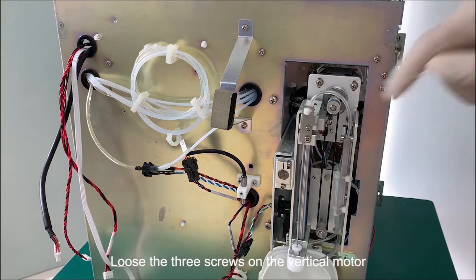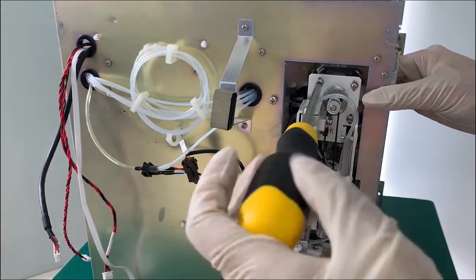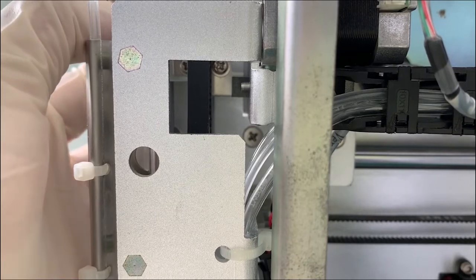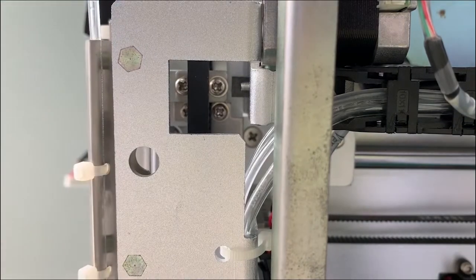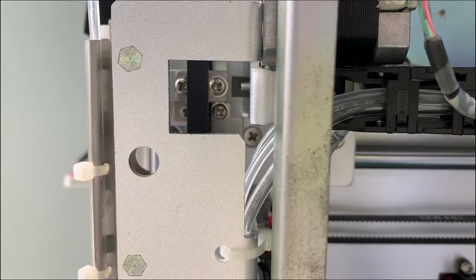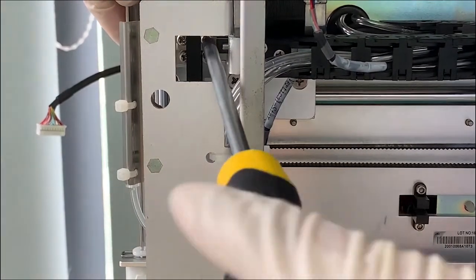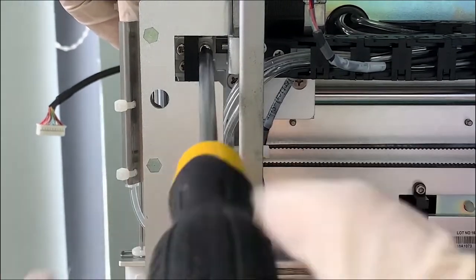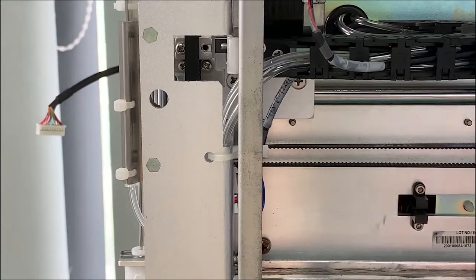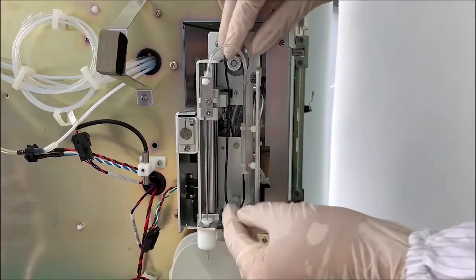Loosen the 3 screws on the vertical motor. Remove the 2 screws which are used for fixing the belt. Take out the old belt.